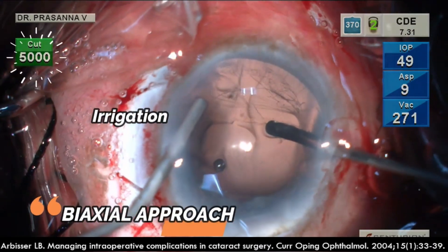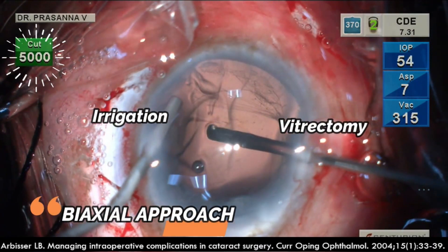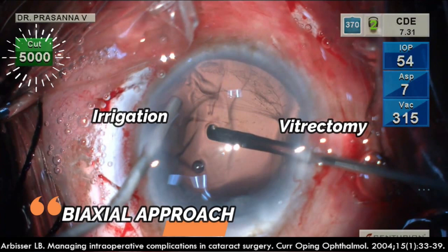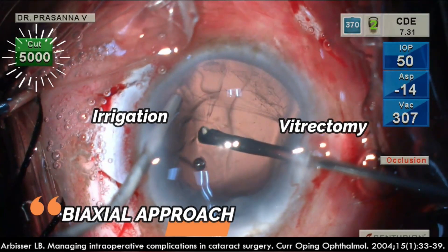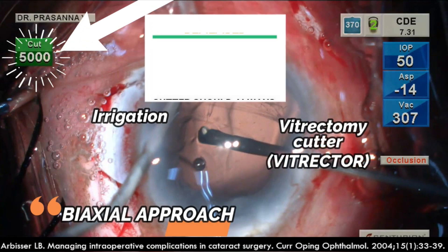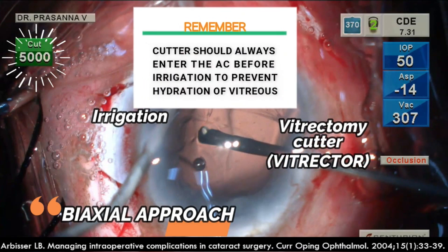Anterior vitrectomy should always be biaxial. Irrigation can be performed with a 23 or 24 gauge cannula directed towards the angle, away from the PCR. This will avoid hydration of the vitreous and prevent further vitreous prolapse. The cutter should enter the anterior chamber first, followed by the irrigation cannula.